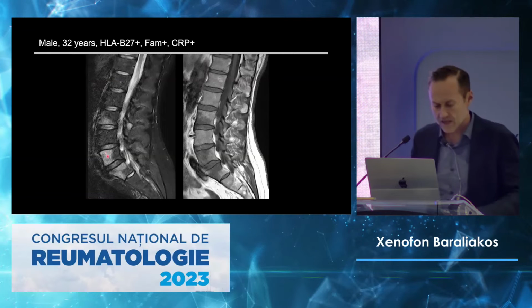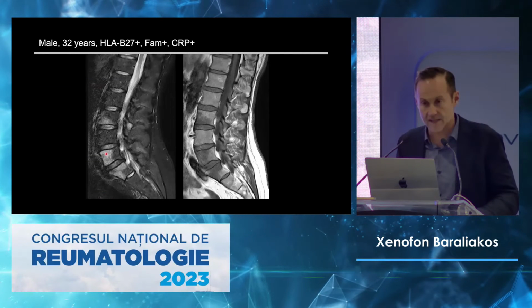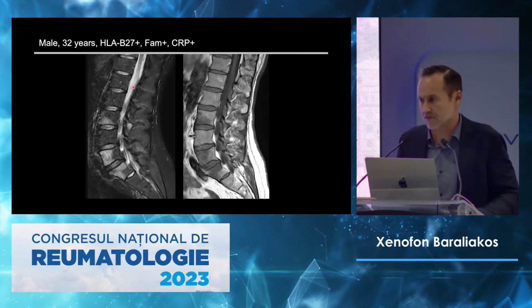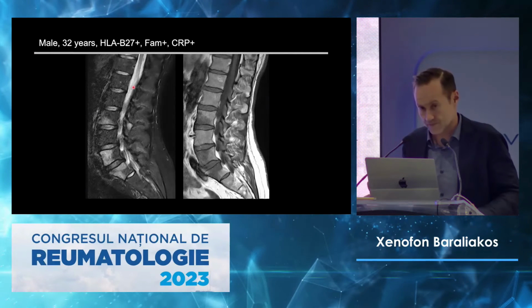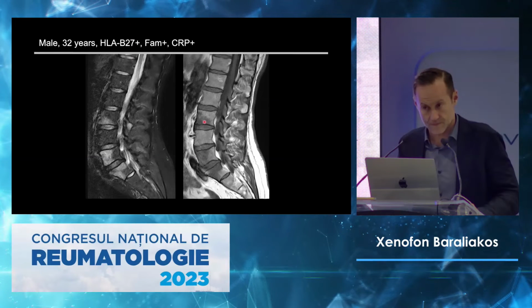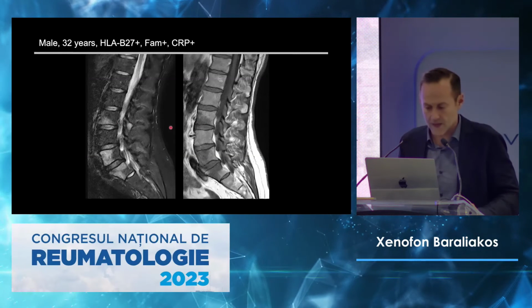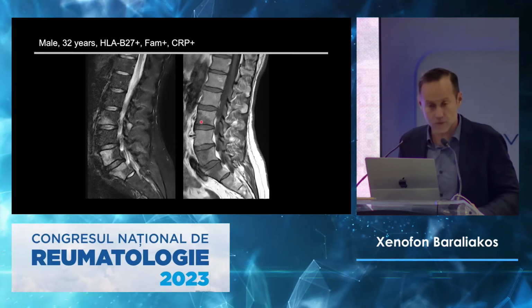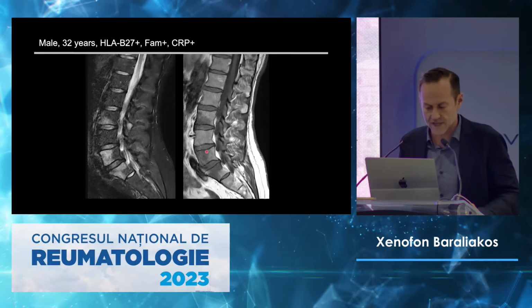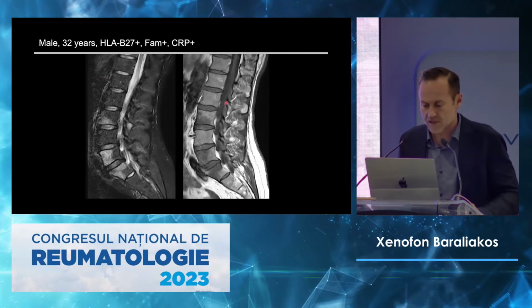This means if I have hyperintense signal, it is as intense in the bone marrow as the water that I have in my body otherwise. If I have hypointense signal, that hypointensity is because this is white, okay? So this means that this cannot be more black than these areas here. And you see that there is some black spots. You see there is darker spots than the water.